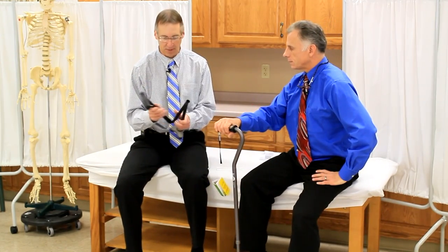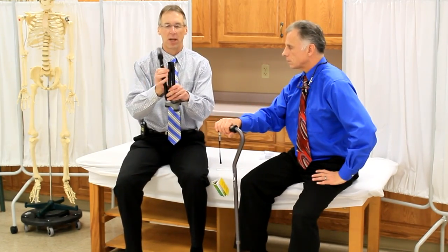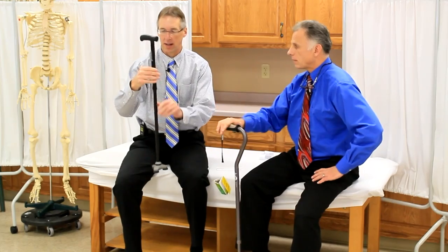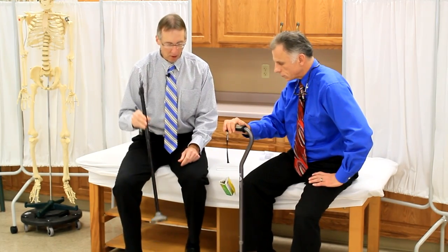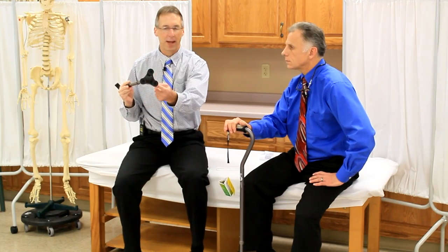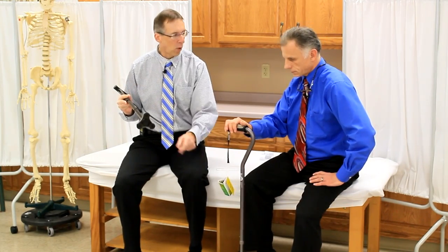So let's go to the canes themselves. This one — the Hurrycane — you can fold up, so that is an advantage. It just comes together like that and works pretty nicely. Both of them have a base: this one has kind of a tri-base and this one has what they call the quad pod.